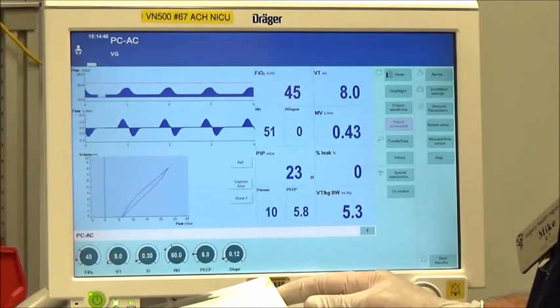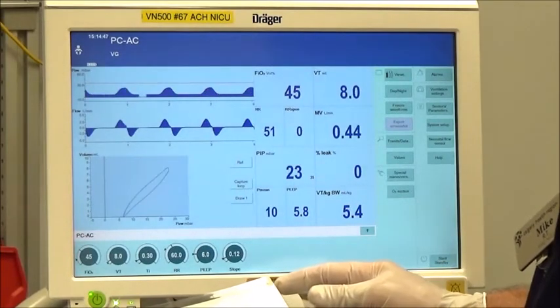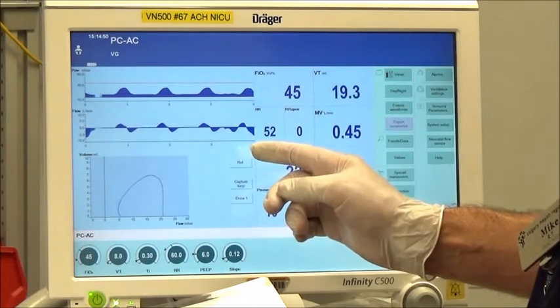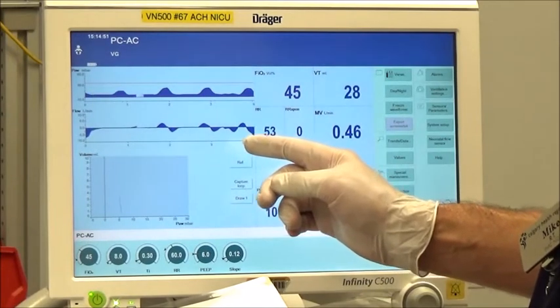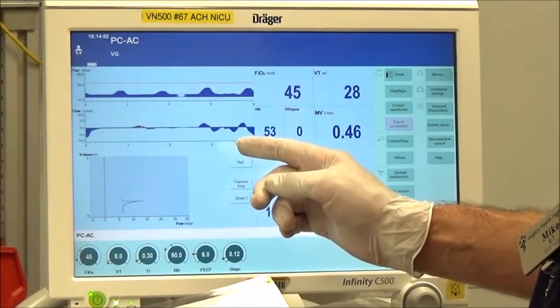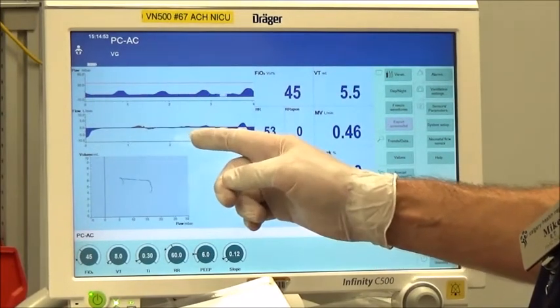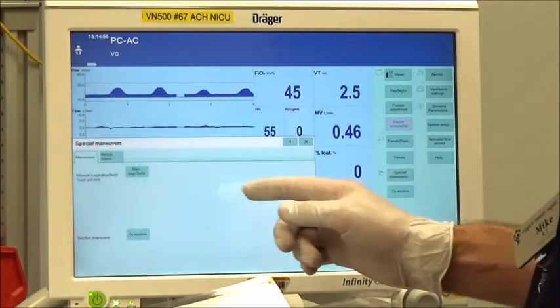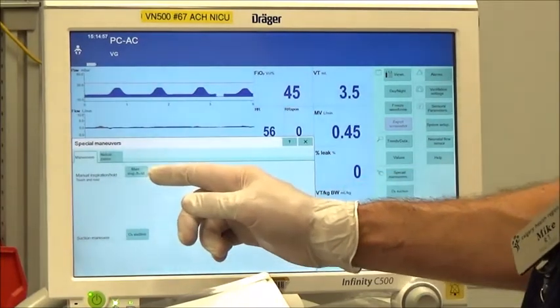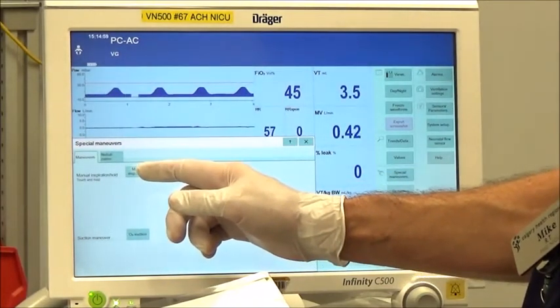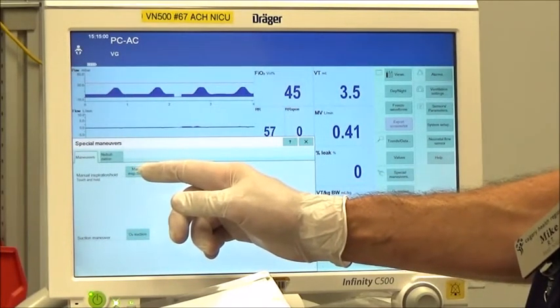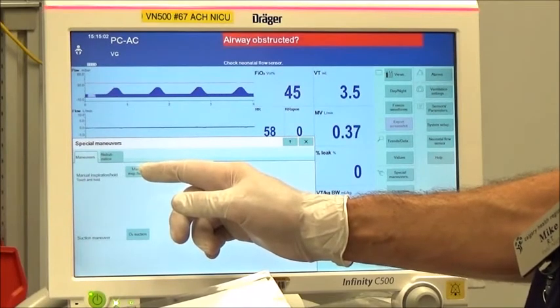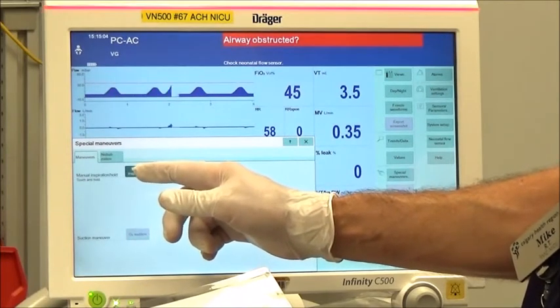As surfactant is administered, watch the ventilator flow waveform and tidal volume to determine ventilation. If ventilation is limited — as observed with minimal flow on the ventilator graph and/or less than the set tidal volume delivered — provide three manual breaths.